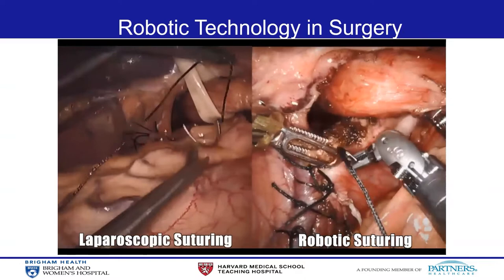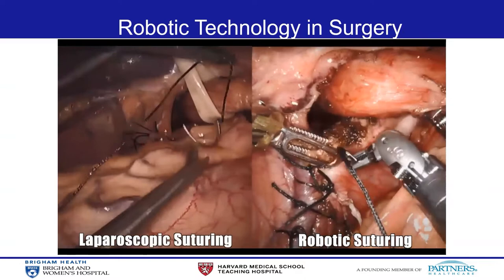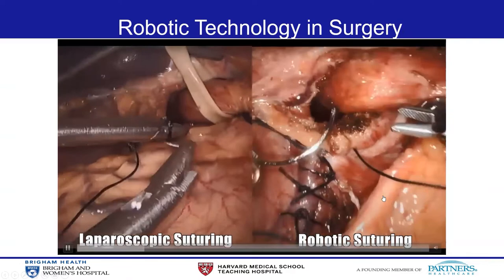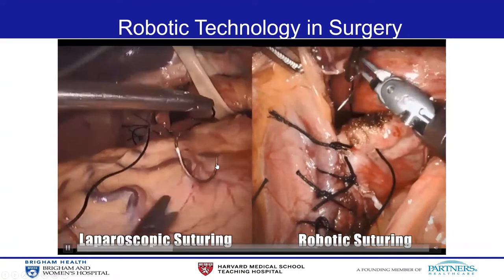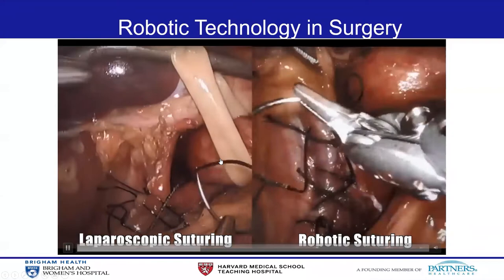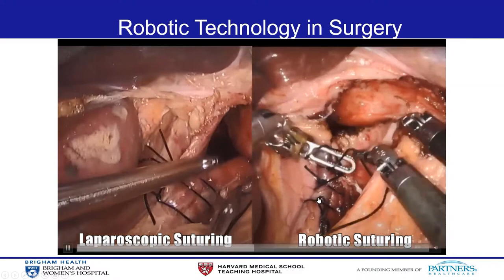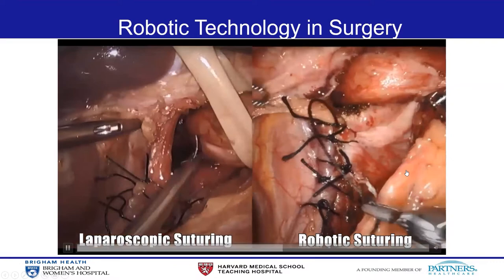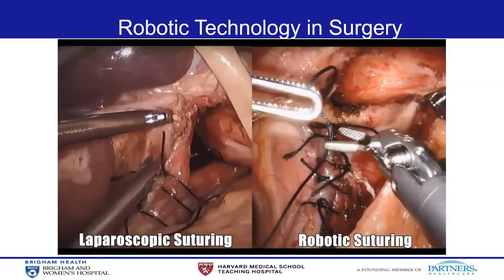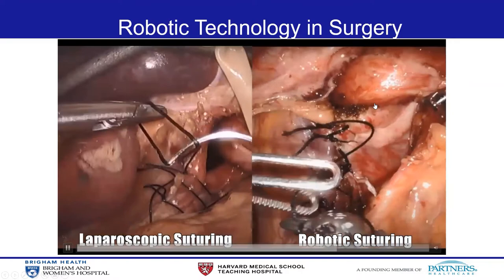This video shows the difference between laparoscopic suturing using rigid laparoscopic tools and robotic suturing using robotic technology. You can appreciate how difficult it is to catch a curved needle using rigid, non-articulating devices to perform a running stitch. However, with robotic technology, the maneuver is smooth and precise because these instruments have multiple joints that allow for triangulation of the instruments and very precise maneuvers.